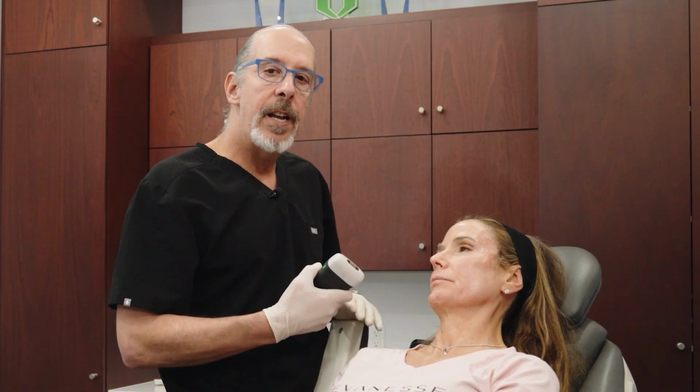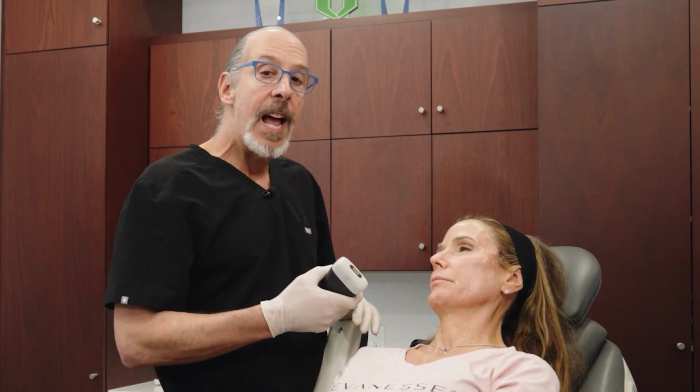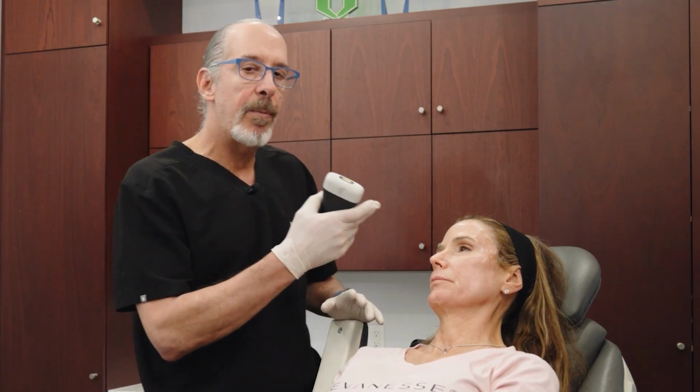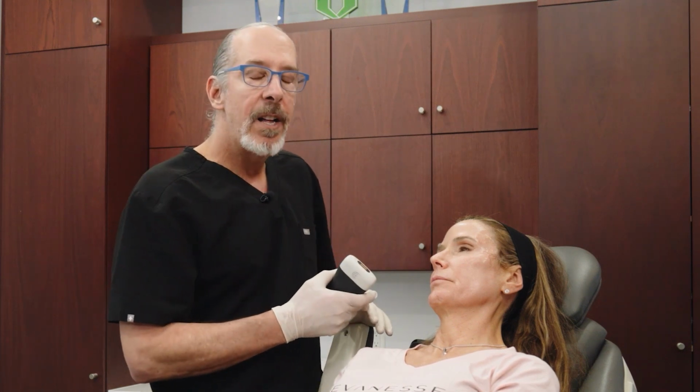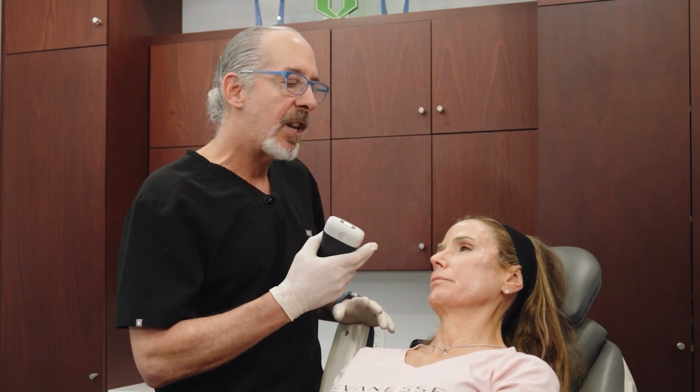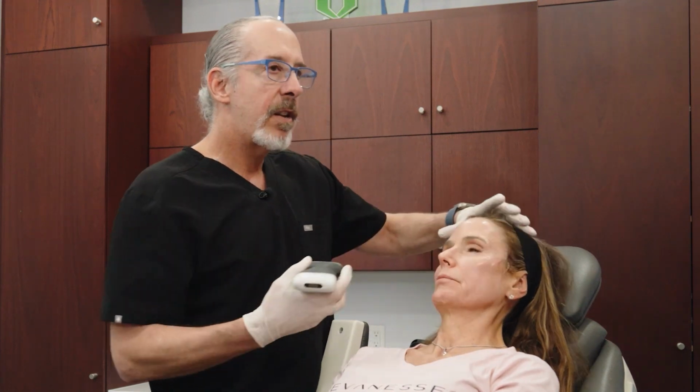So while I was doing this examination, the patient did remind me that she had surgery because she had a pseudoaneurysm of her superficial temporal artery from a trauma case. So I'm not going to find that superficial temporal artery on this side. So we can take a look at this side.